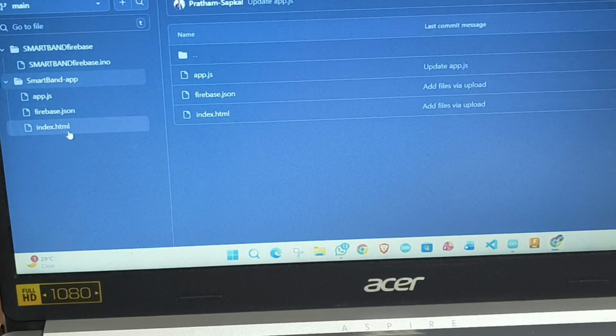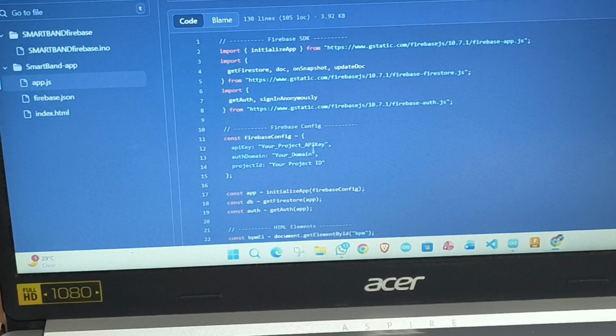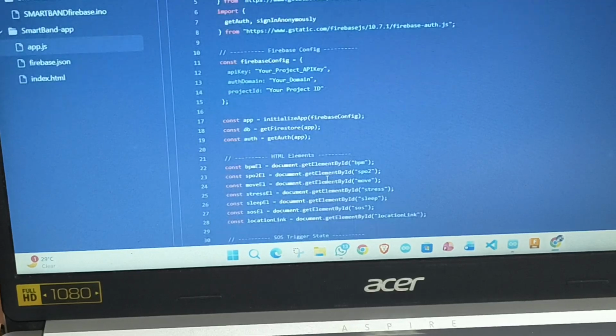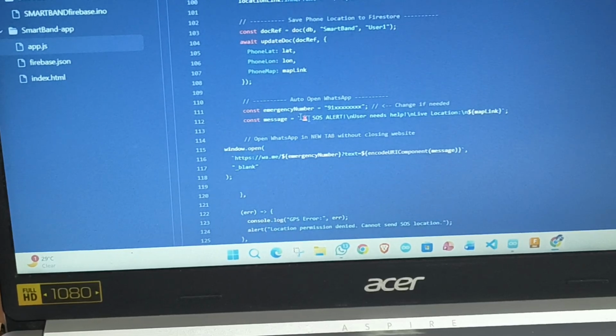And this is my smart band app script. Similarly, to fetch data from Firebase, you have to get the API key, authentication domain, and project ID. And this will take the access of your data, and also an SOS emergency number, which I have mentioned here.